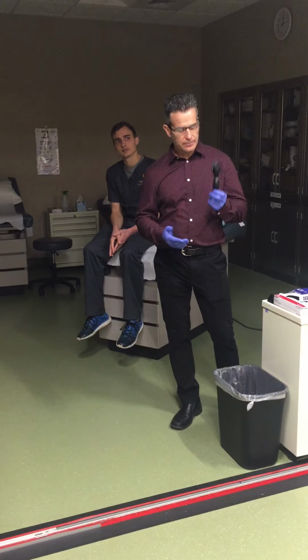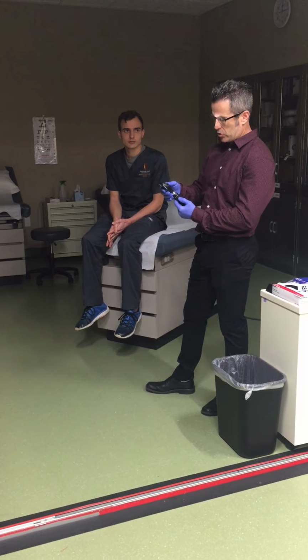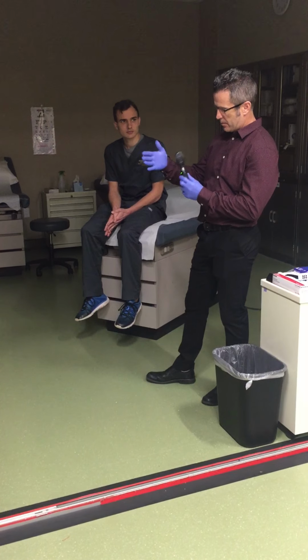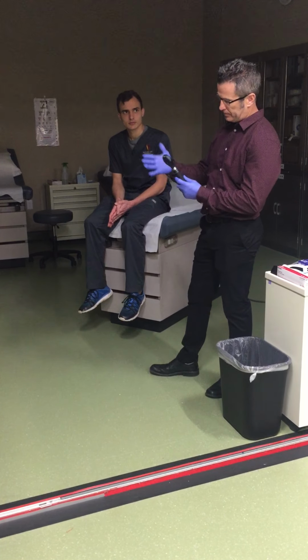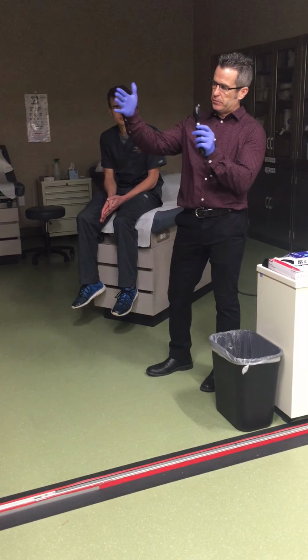And so I turned it on. So I want to hold this up to my hand, and I want to see which aperture I want to use. So that's blue, I don't want that. This is white, that's about a good size. That's a little bigger. So let's go, if you got this one kind of straight up at 12 o'clock, your dim button on these is here, and you got to hold it till it dims.